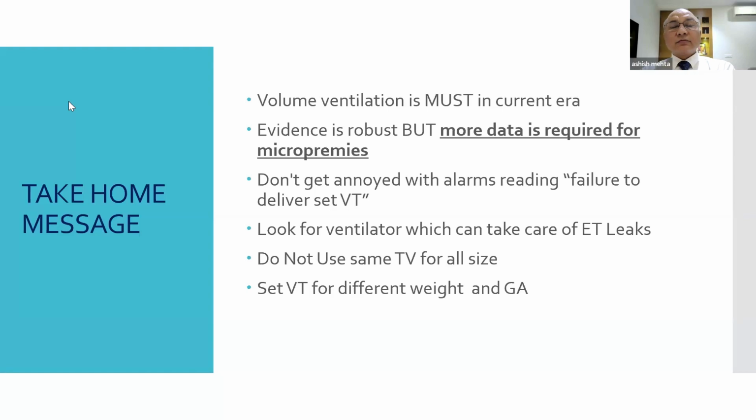True. And also, like in the beginning of the presentation I told you, never rely on the distal flow sensor, the flow sensor which is there inside the ventilator. Always rely on the proximal one. Many times the company will say, sir, the flow sensor is there inside. Don't believe that. That is not used in neonates. Even people say till infancy, till 10 kg, it is not reliable. After 10 kg you can rely on that, but definitely not in the neonatal period.